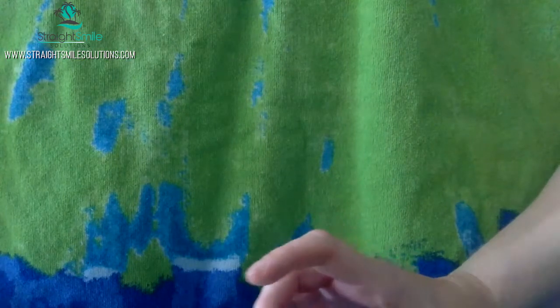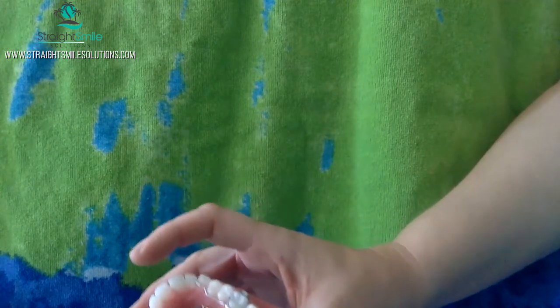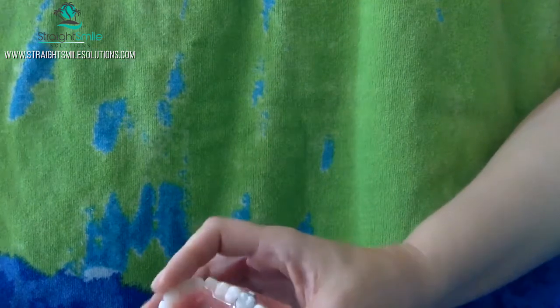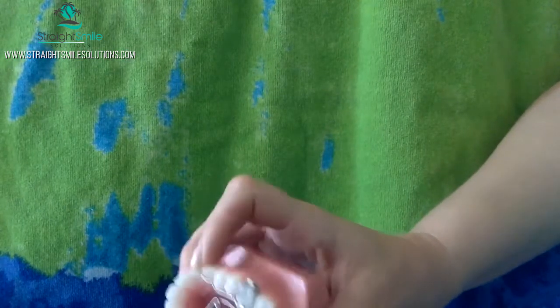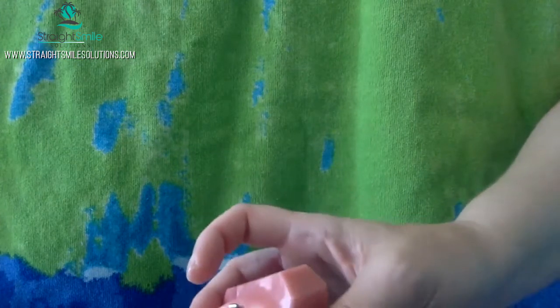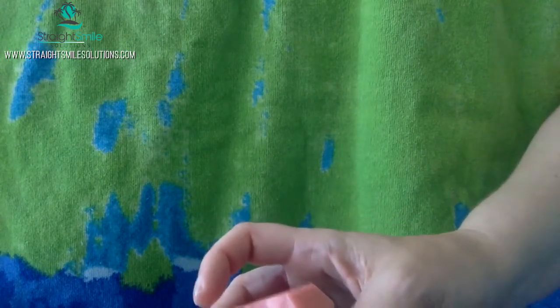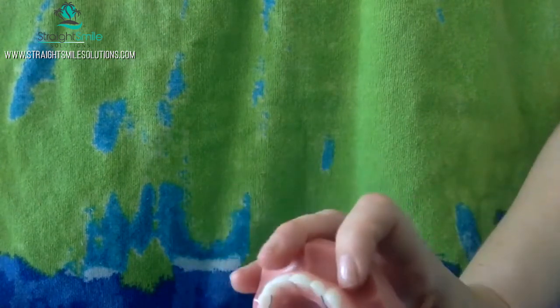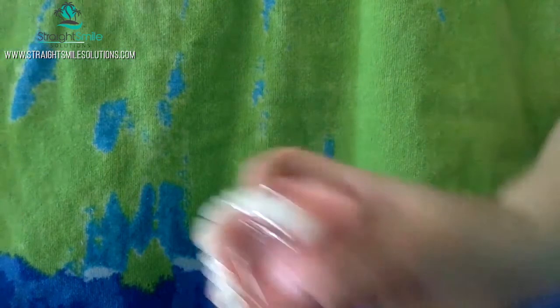If you want more expansion in the posterior region, then you're going to pull a little bit more down here. There's not an exact science, and the beauty is you're going to see these patients every three to four weeks anyway, so you want a little bit more expansion than you're looking for, ideally. Obviously, other things you'll be doing are checking the buccal roots as you go along, checking for mobility, sensitivity, things like that — bite opening up. For the most part, it's a pretty easy appliance once they get used to it. The first week is rough, but that's pretty much it.